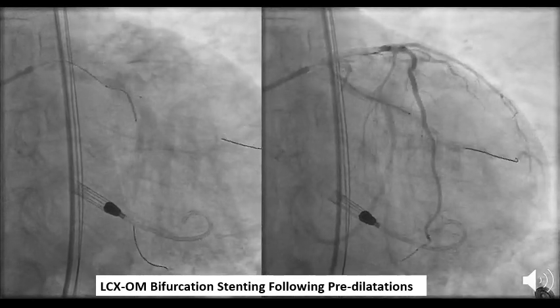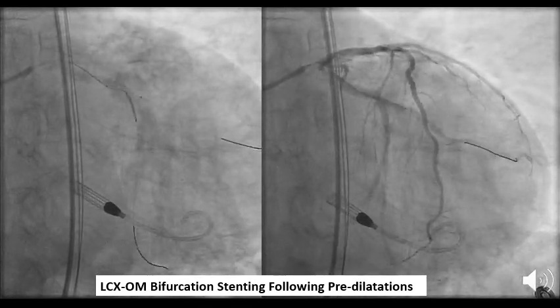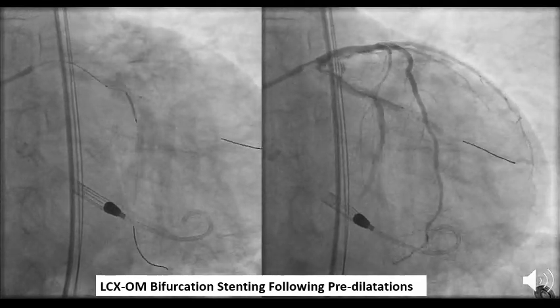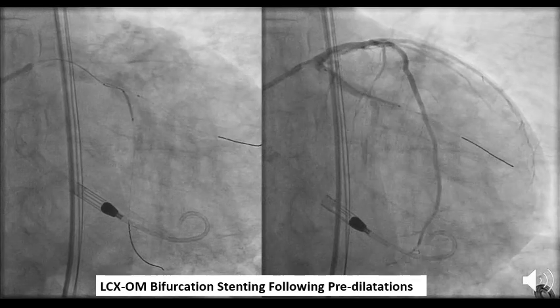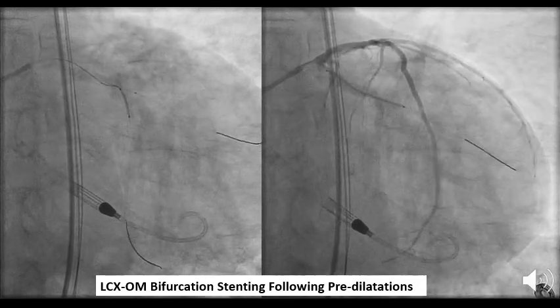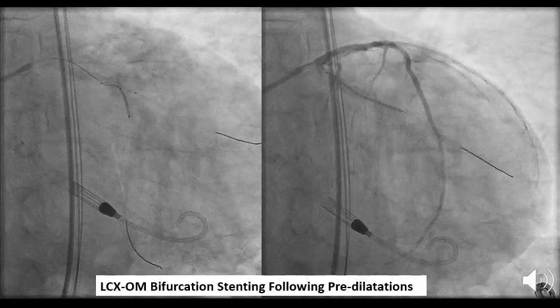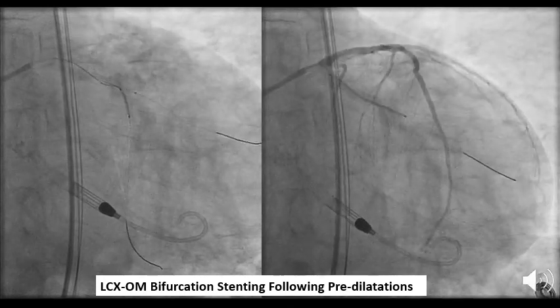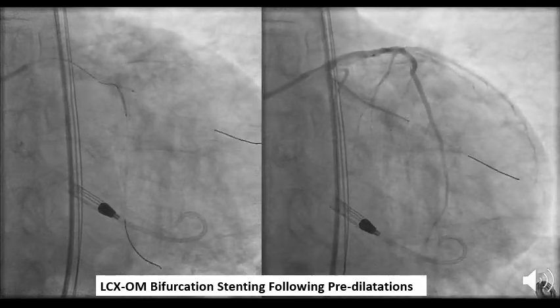2 stents in the obtuse marginal branch and circumflex main branch were placed. As you can see, the first stent, after predilations of both lesions, was placed in the distal circumflex and was positioned with a balloon in the obtuse marginal branch. After deployment, the stent was post-dilated and a 3.0 times 38 millimeter stent was placed in the obtuse marginal branch, and then bifurcation kissing balloon angioplasty was performed. The final result of the circumflex and obtuse marginal branch interventions is on the next slide.